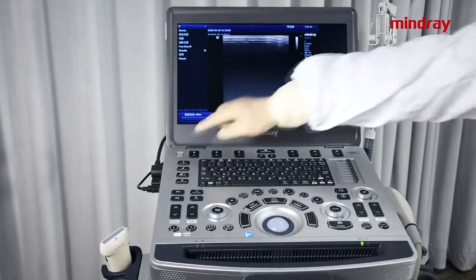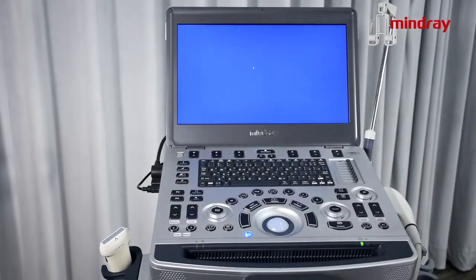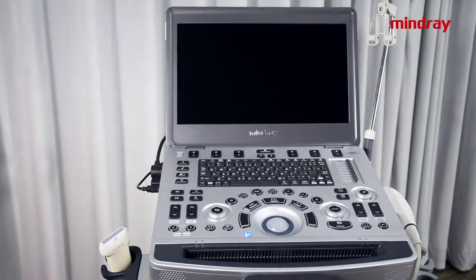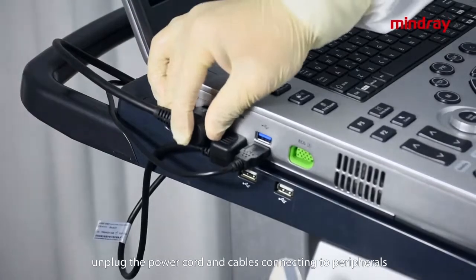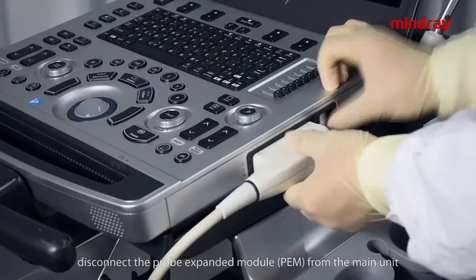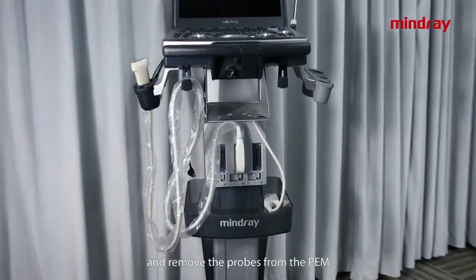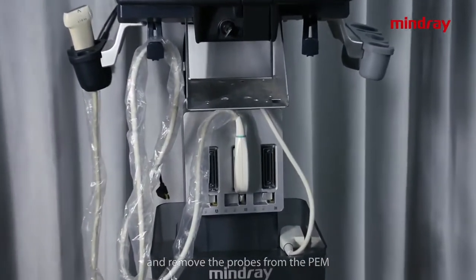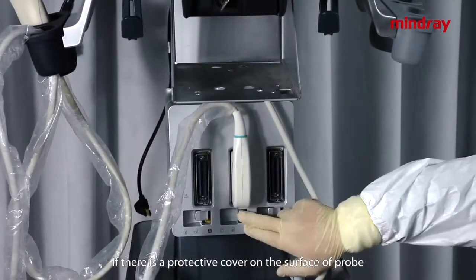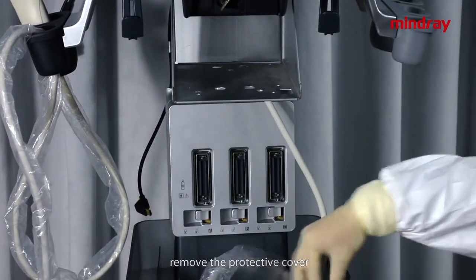Cleaning. Turn off the machine. Unplug the power cord and the cables connecting to peripherals. Disconnect the probe expanding module from the main unit and remove the probes from the PEM. If there is a protective cover on the surface of probe, remove the protective cover.